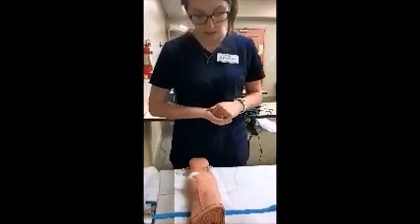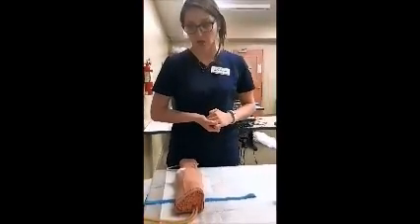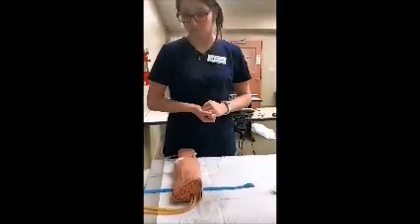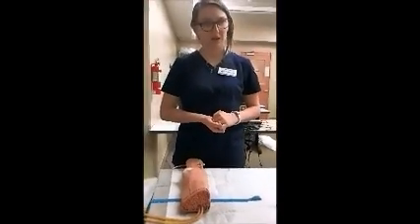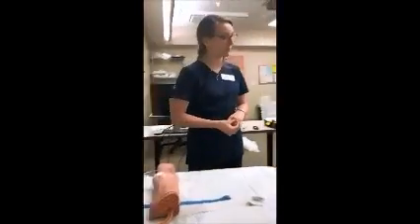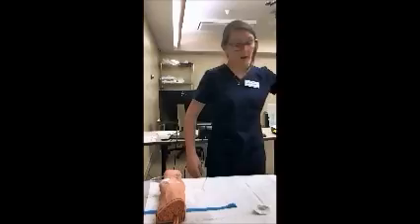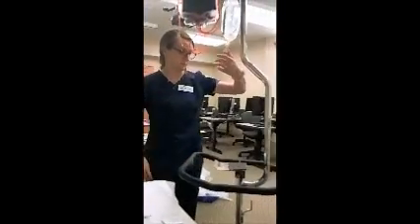Joe, have you been having any pain in that site at all today? Nope. No pain. And you haven't noticed any redness or swelling or any weird feeling in general in that area, have you? No, nothing like that. Oh, good. All right, well, if you don't mind, I'm just going to check this drop rate. The rate this little drop is going down here, it's got to go a certain number of times a minute. So I'm just going to double check it and make sure it's running right, all right? Sounds good. I'll just keep watching my show.